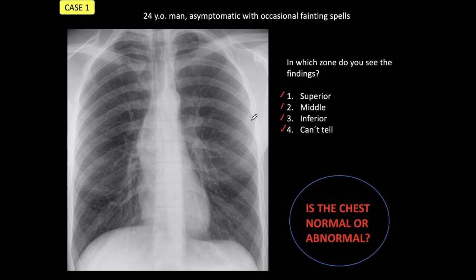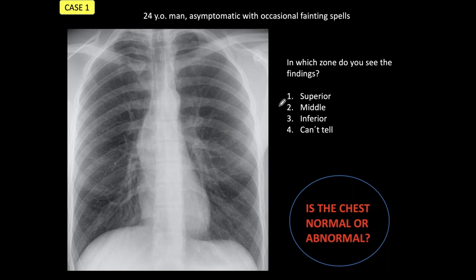We are back and the abnormality to me is very obvious. There is convexity of the right side of the middle portion of the mediastinum. Normally, this is identified as dilatation of the ascending aorta, which is the most common cause of this abnormality. So the answer is: the lesion is in the middle mediastinum.